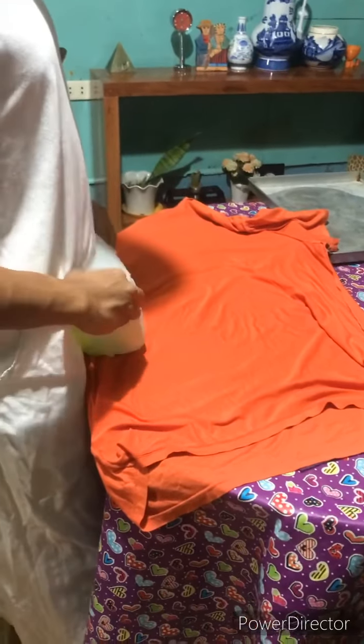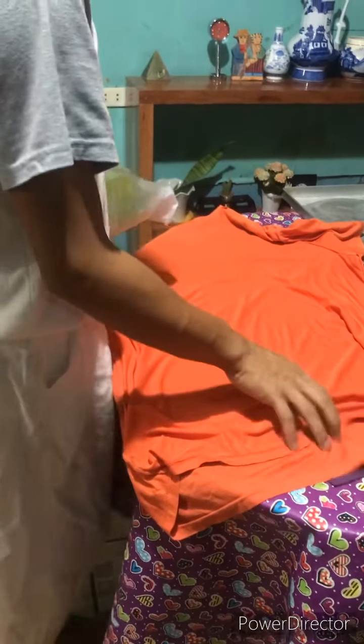Document the nursing practice appropriately, monitor adverse effects, and report any abnormal findings immediately, to ensure safe practice and enable prompt, appropriate medical and nursing intervention to be initiated.